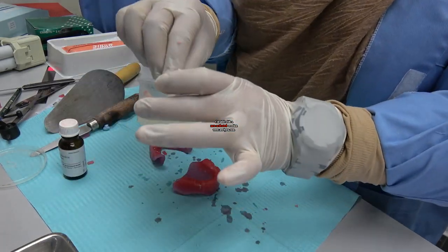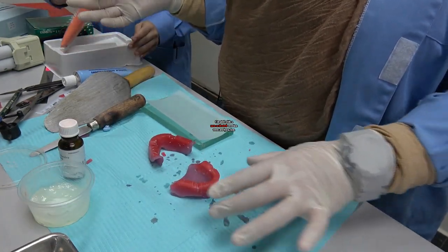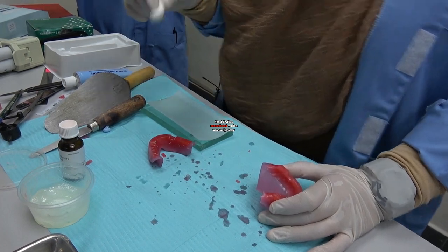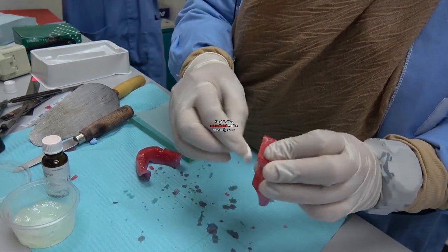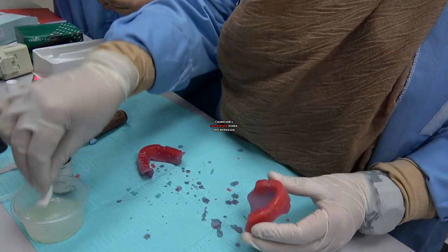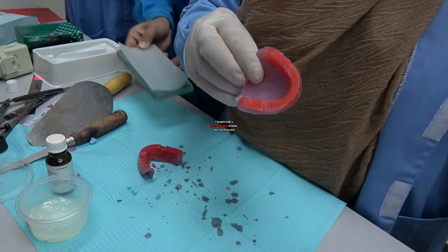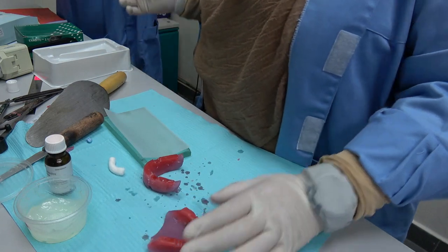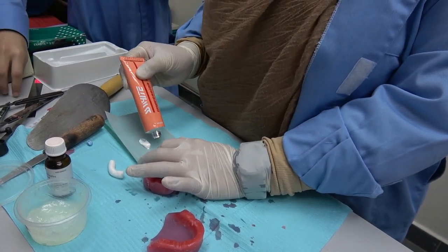If let's say you have to redo, remove this, to use ZOE. In the clinic, we don't use zinc oxide anymore. For the bite registration, we use Exabite. But for you, if you have to redo it for the second time, third time, or so, you have to use zinc oxide. First of all, you place the Vaseline on the V notch area, on the maxillary arch only. And then apply some paste. We just need a little zinc oxide, not that much.